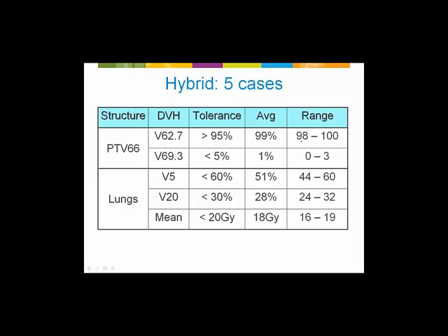And particularly when you're talking about late-stage lung cancer and all of the variation in target size and location, you can guarantee there's going to be variations in what an IMRT plan looks like. So the way I approached it was to solicit some help from three other Canadian cancer centers in how they might approach a problem like this. So I took the centers that were involved. Two of them were also, like our site, full Varian. So they were using Eclipse, Varian, Linacs.